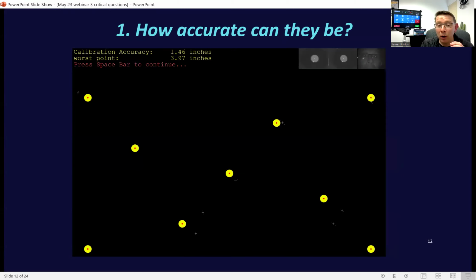First, here's someone who's not quite there. So we see that there are 9 calibration points to look at. Those are the yellow balls. And what we can see on this splash screen is very interesting. You'll notice behind the yellow icons is a black screen. So high contrast and low distraction. I want you to focus on the lower right point. So we wanted them to look far right and low in the screen, that lower ball right in the corner.